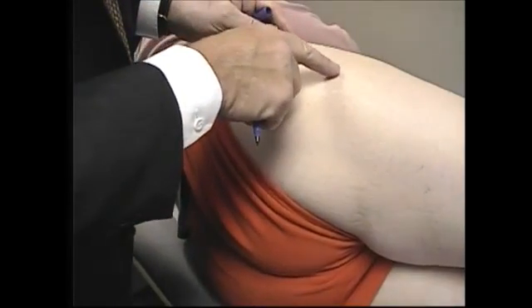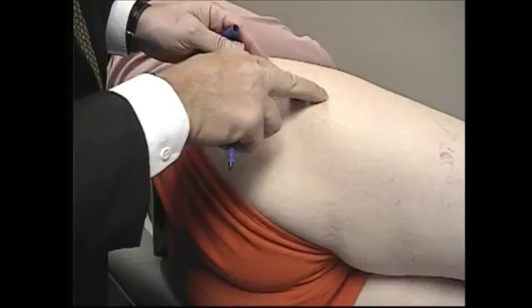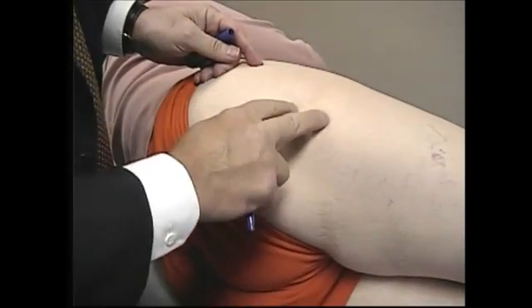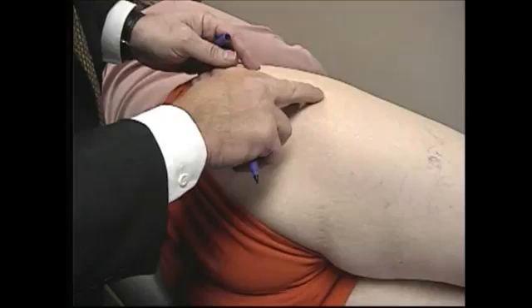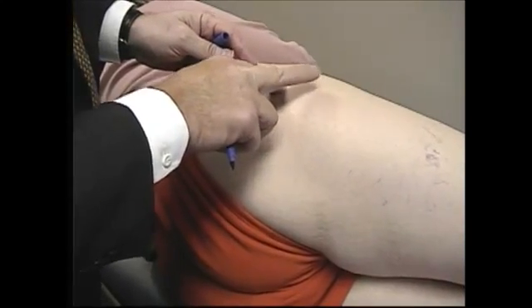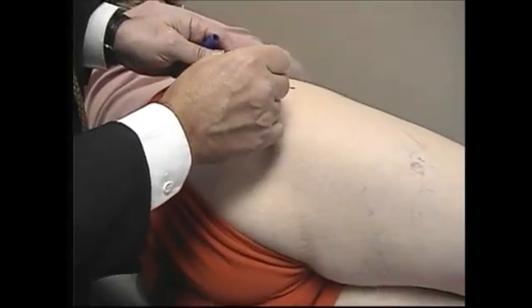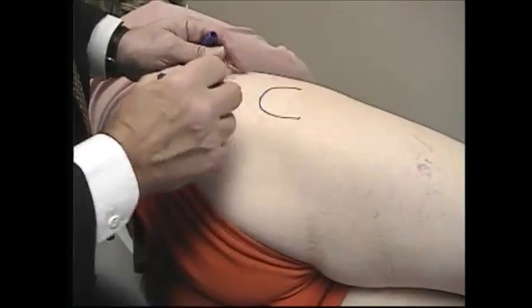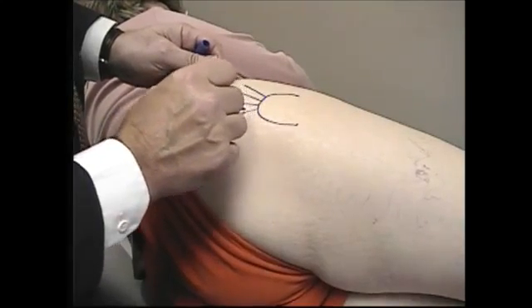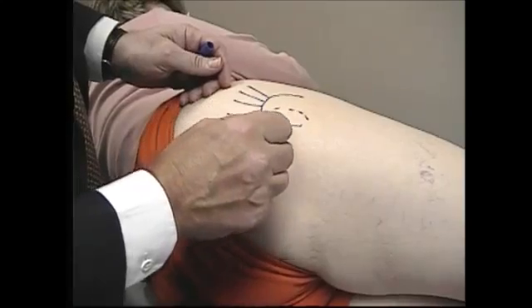The florid abductor tendinitis — if we palpate here, this is the greater trochanter. The greater trochanteric bursa is mainly posterior to the greater trochanter, and her pain is right here in the area of the abductor insertion. You can see her wince when pressing down here. So I'm going to outline the greater trochanter, and then the abductors come in like this, and then the greater trochanteric bursa actually sits back here.